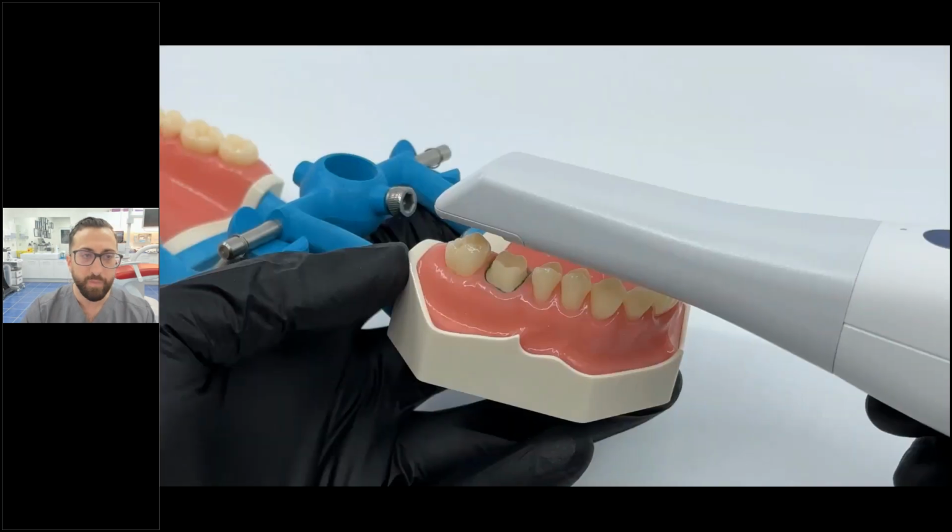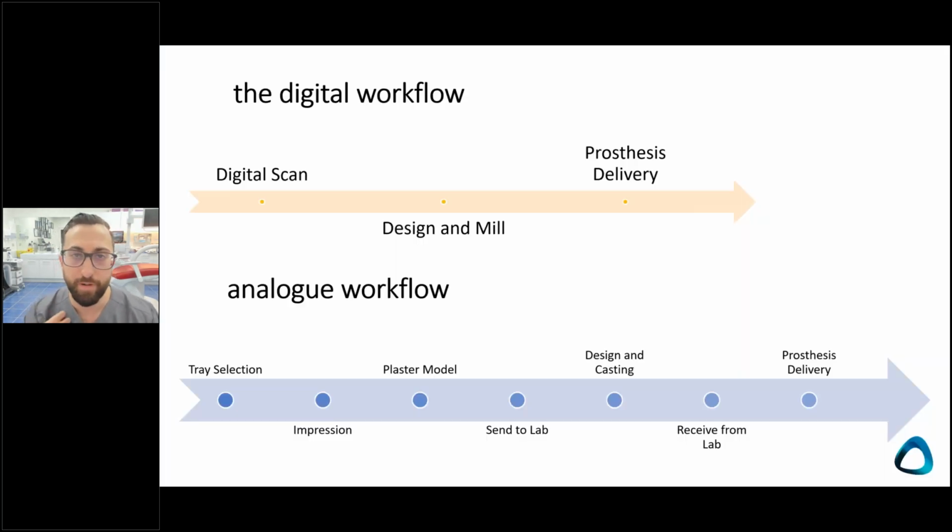Now, why the digital workflow? It's quite self-explanatory why these days, but it's just more efficient. Not only is the scan faster than an impression for most experienced clinicians, and you can be experienced too with a bit of practice, but also the dialogue with the lab is a lot faster. Sending a scan to your lab is like sending an email. It is so fast and quick these days, and they can immediately get the file and start working on it.